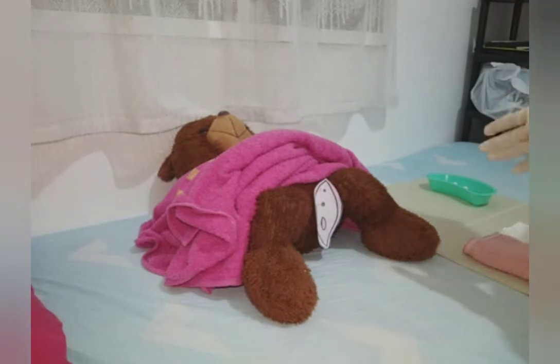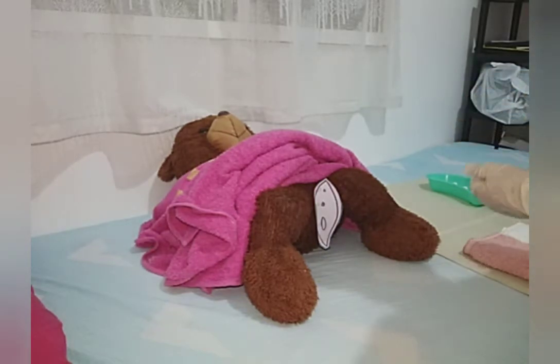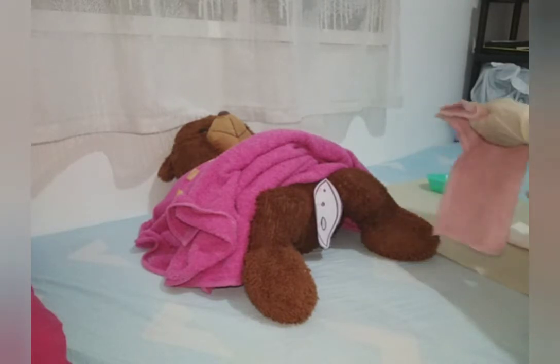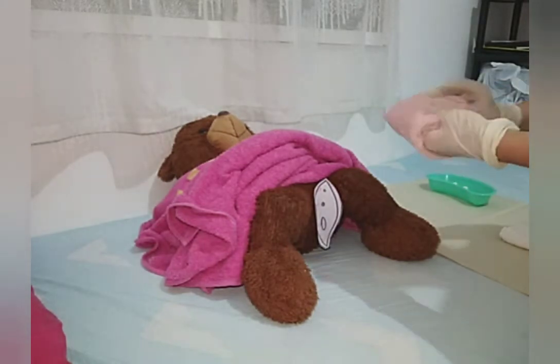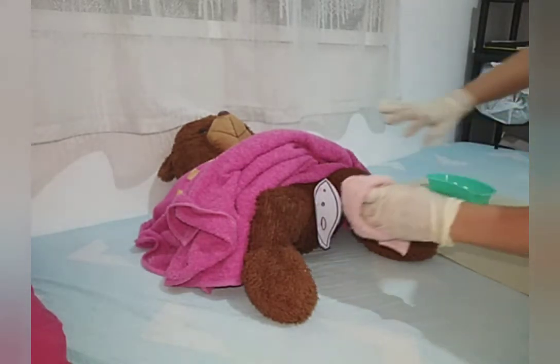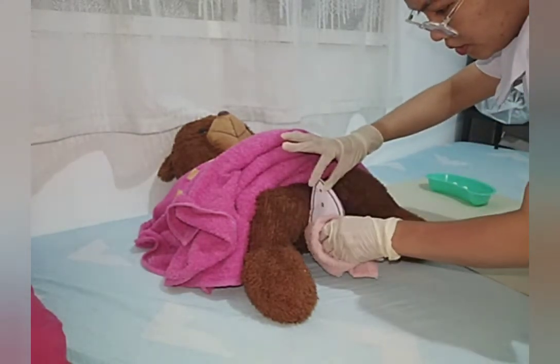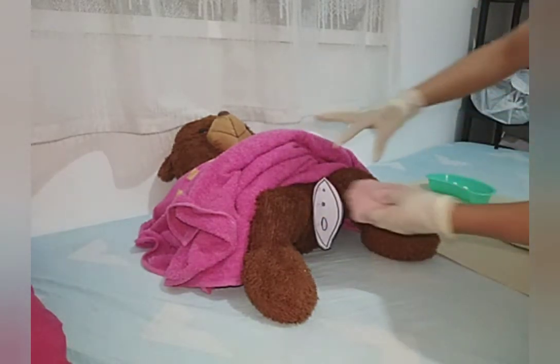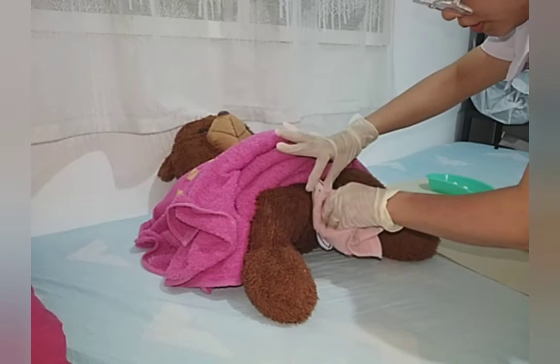Now we will clean the perineal area. We'll use soap and water. First I will apply the soap. I will clean from the farther side, and we will cleanse again from the side, top to bottom, and in the middle.